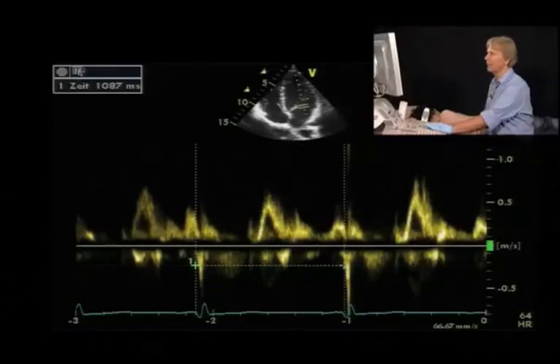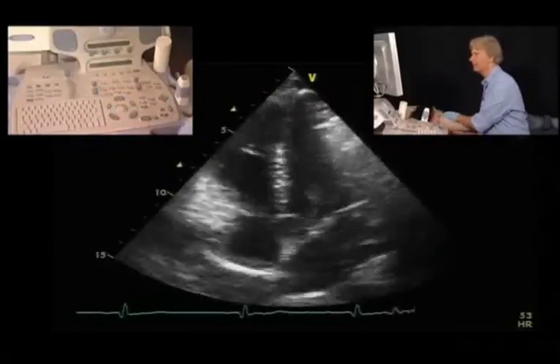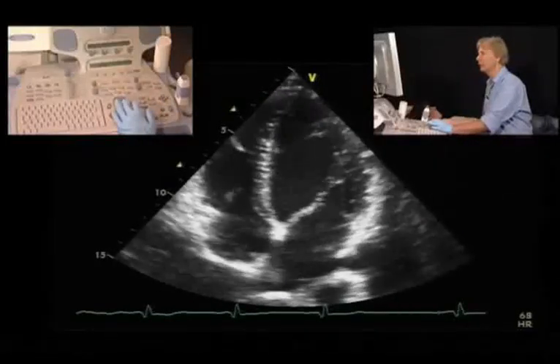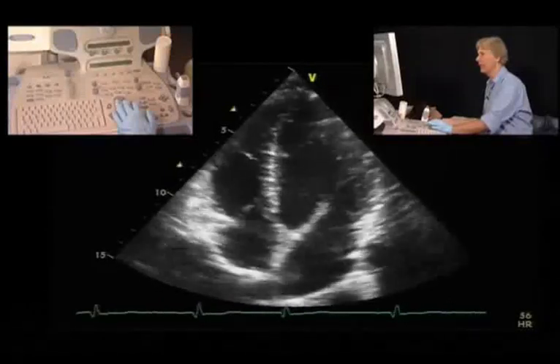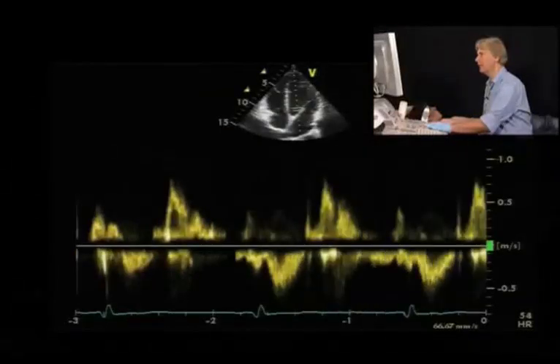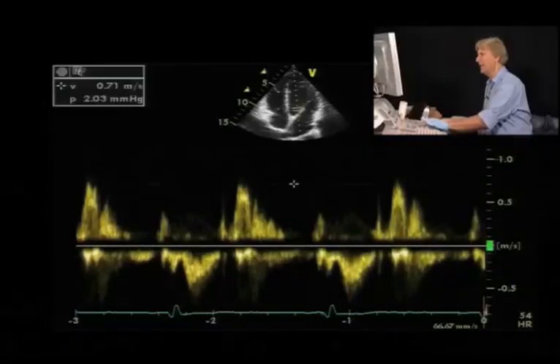The next thing that you can measure in such patients is the isovolumetric relaxation time. To do that, you need to also get an LVOT outflow signal, and to do that you need either a 5-chamber view or a 3-chamber view where you can see the LVOT. Then you place the signal right here in the LVOT, close to the mitral valve, and then you have both signals.